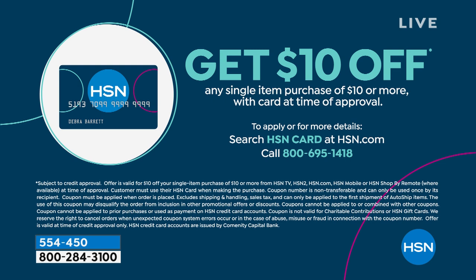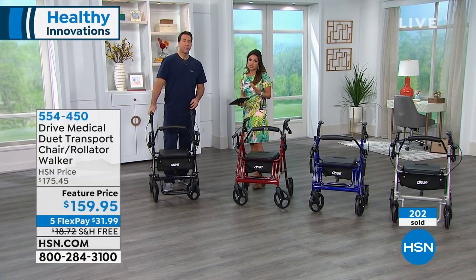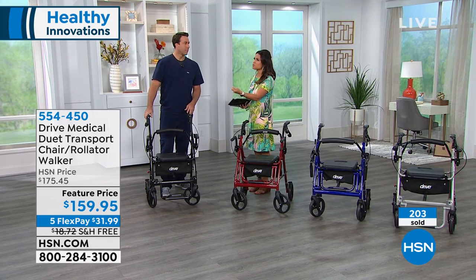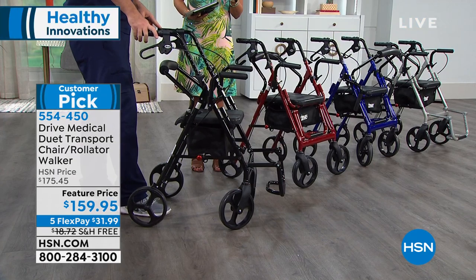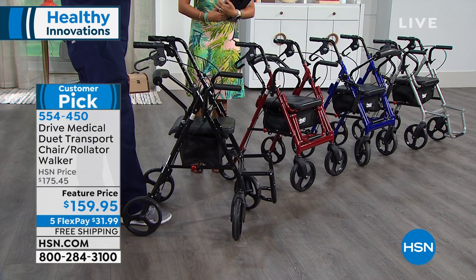We are running a special right now as well — if you'd like to apply for the HSN card, when you're approved you can use it and take an additional $10 off any single item purchase. So over 200 of these are gone already, because so many of us are either personally affected or know someone with that feeling of limited options when it comes to mobility. And you don't have to have that anymore — you need to have freedom, and that's what this gives you.